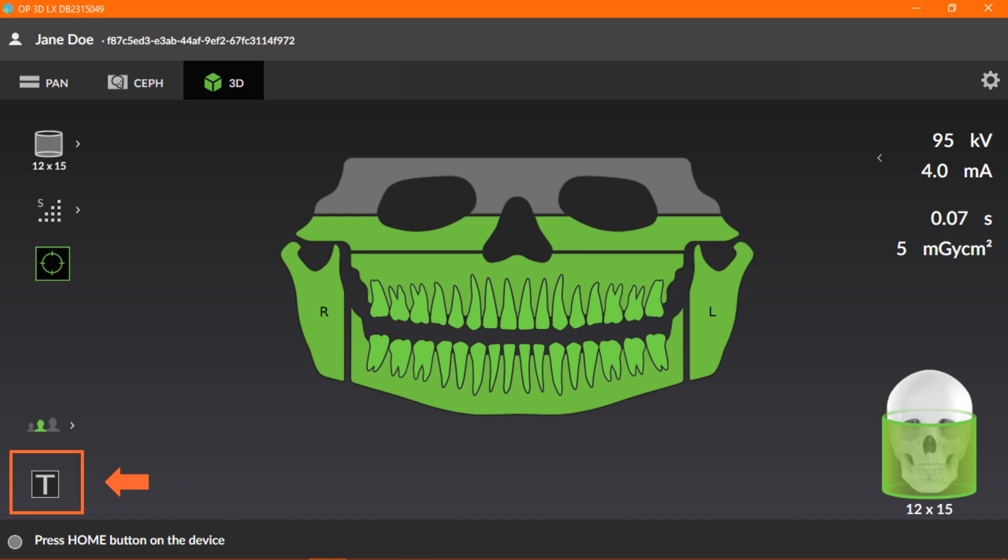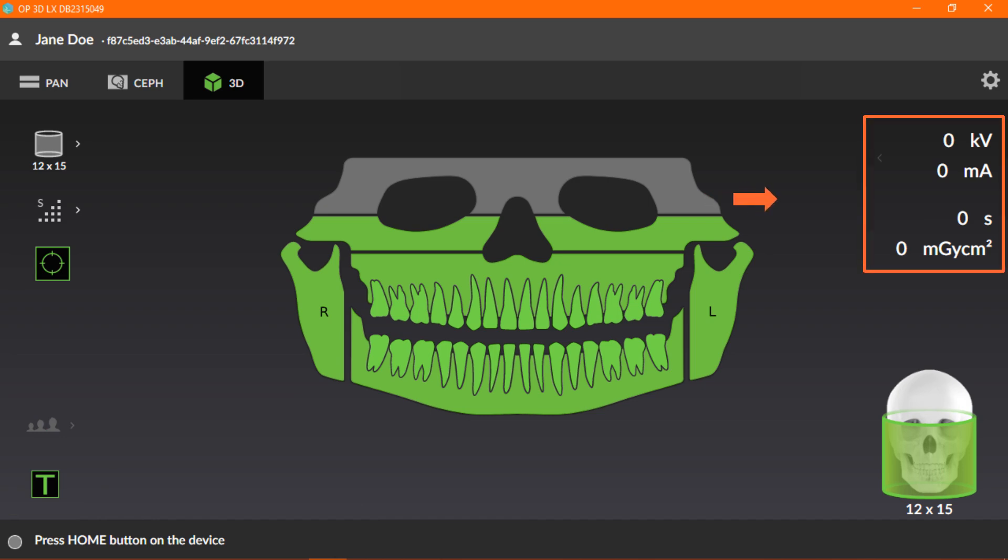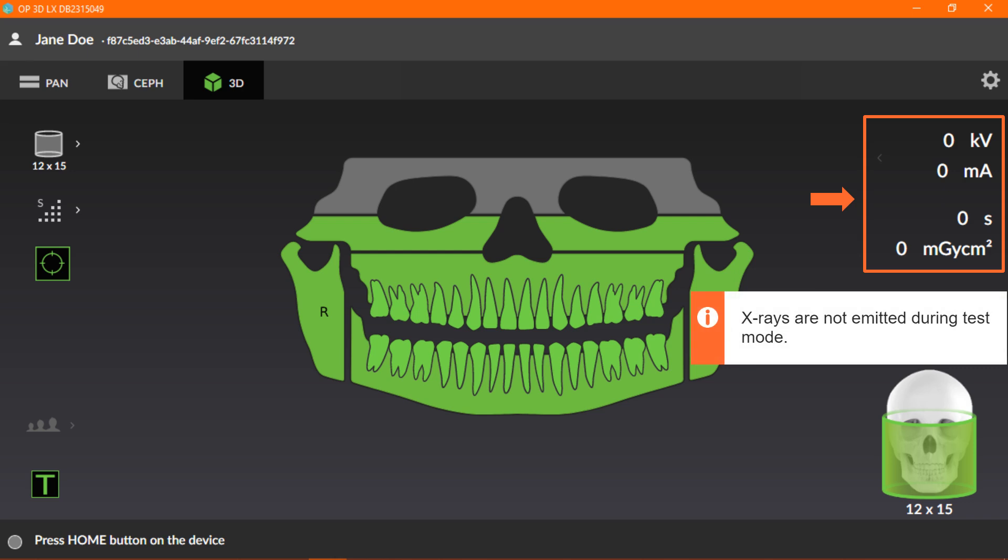The last icon is the test mode icon. Click the icon to place the unit in test mode. Note, the radiation values will change to zero and x-rays will not be emitted during test mode. Test mode can be used to demonstrate the device movements and to ensure the rotating device doesn't make contact with the patient during the imaging process.